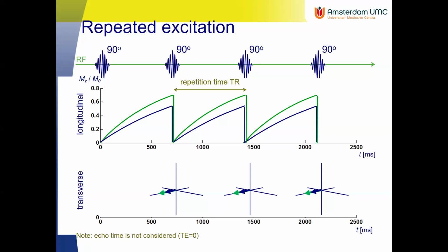But during that process, we're going to interrupt it at the time point where they didn't fully go back to their equilibrium state, because then we can't see any difference in relaxation speeds because they've all gone back to equilibrium. So while that is happening, we can detect the signal change by doing another 90 degrees excitation pulse. Then we rotate that difference in longitudinal magnetization into the transverse plane. And the signal in the transverse plane is something we can detect with our antenna.